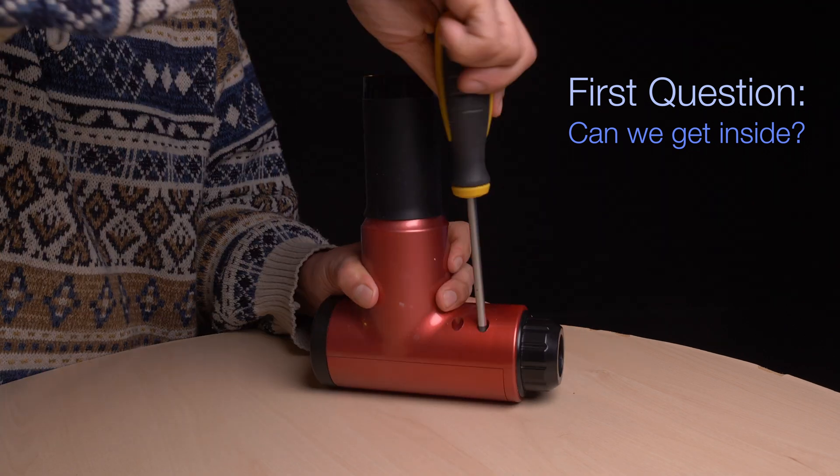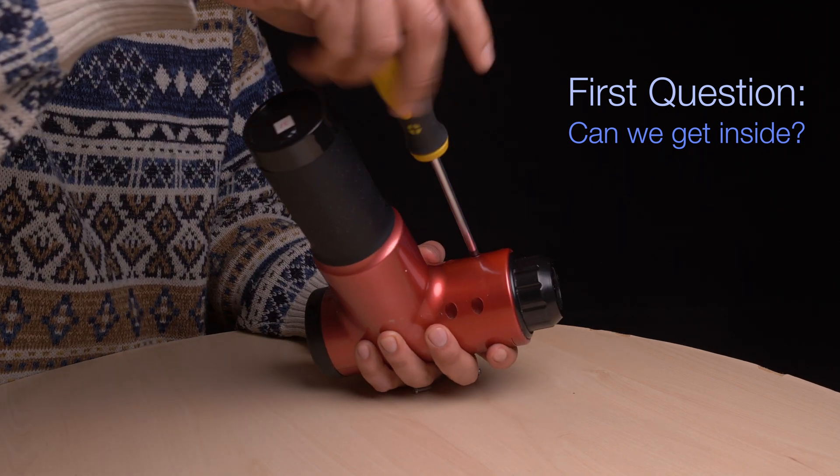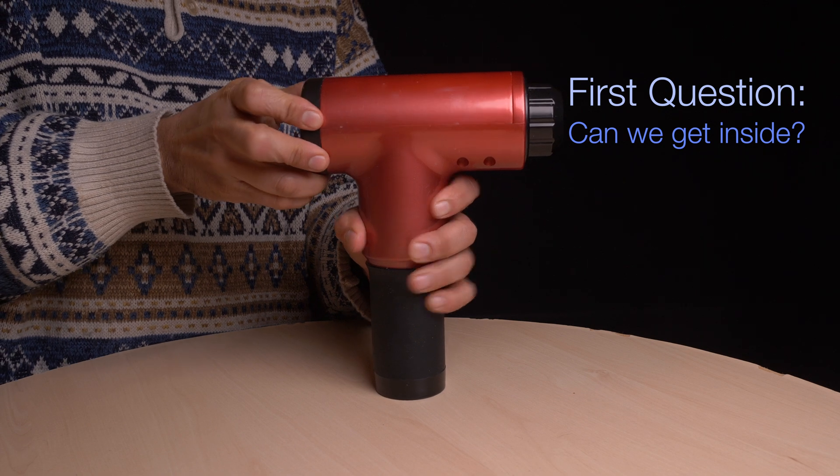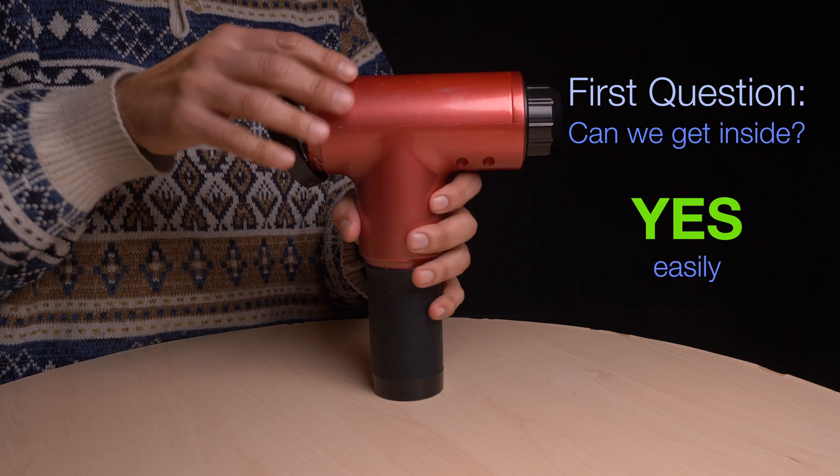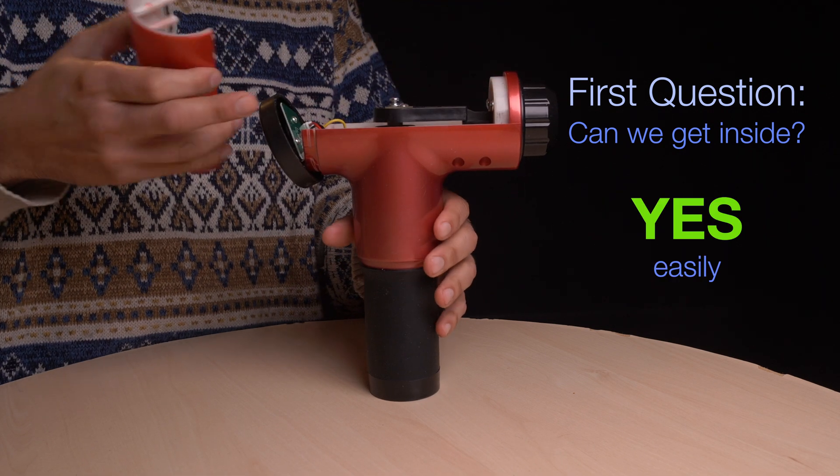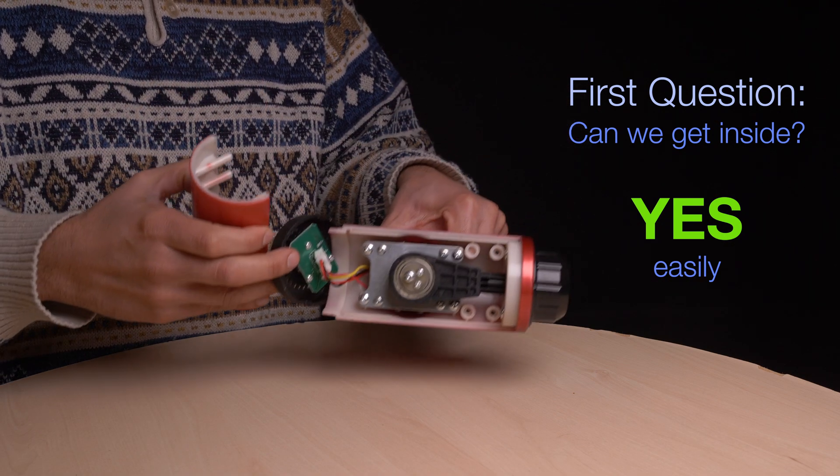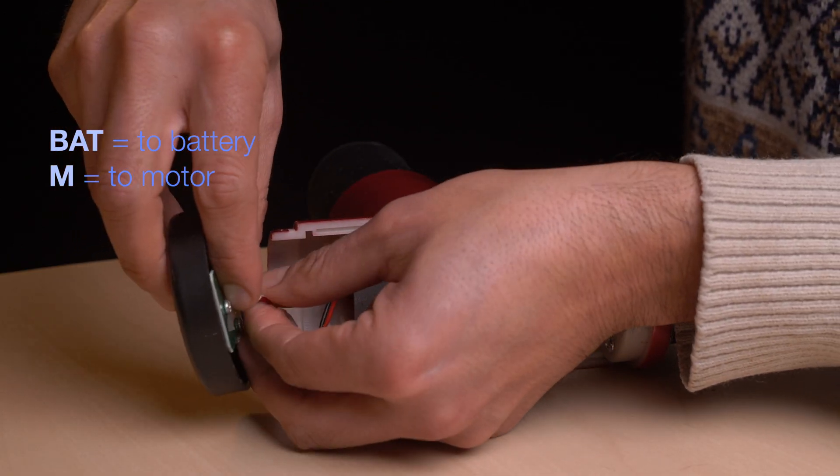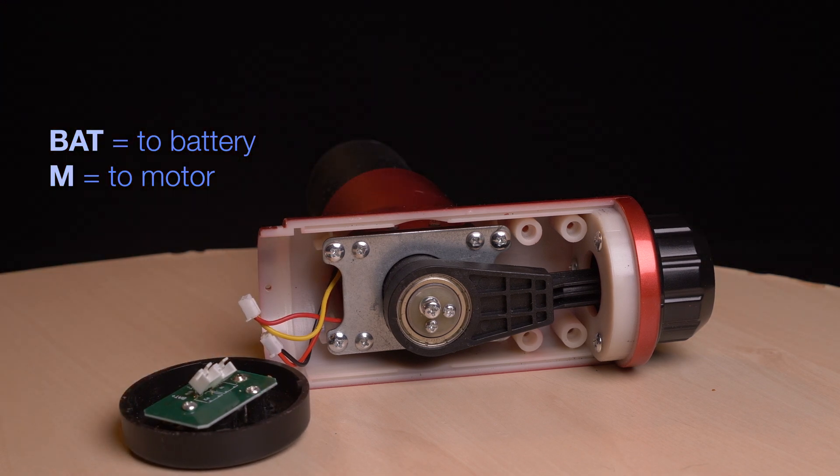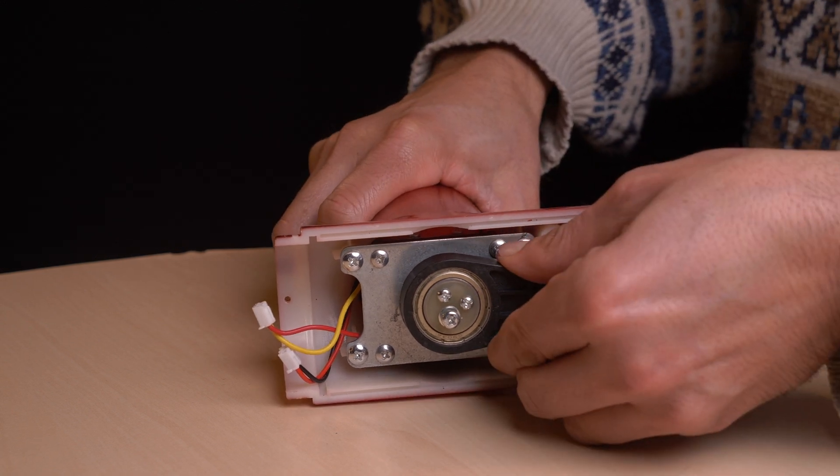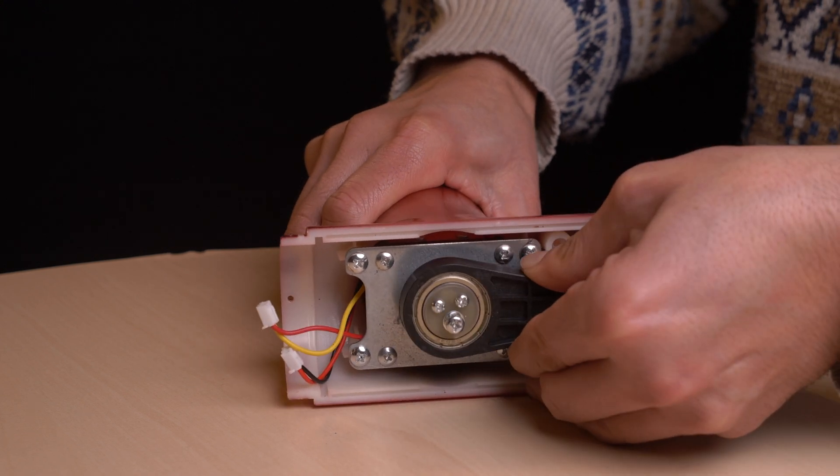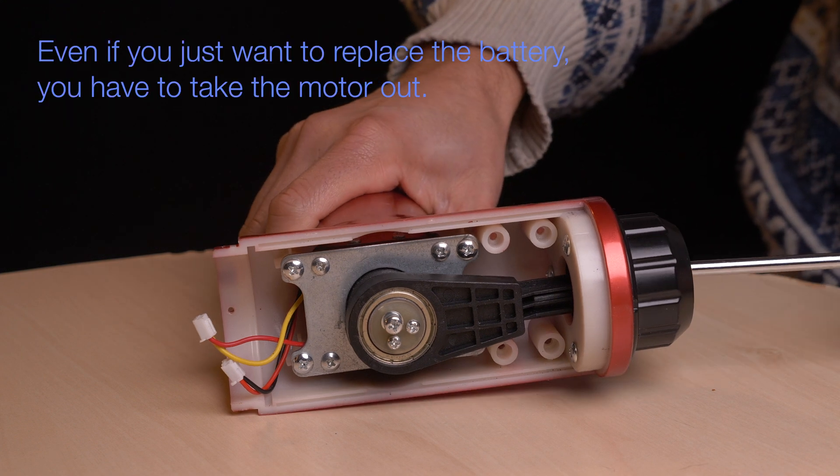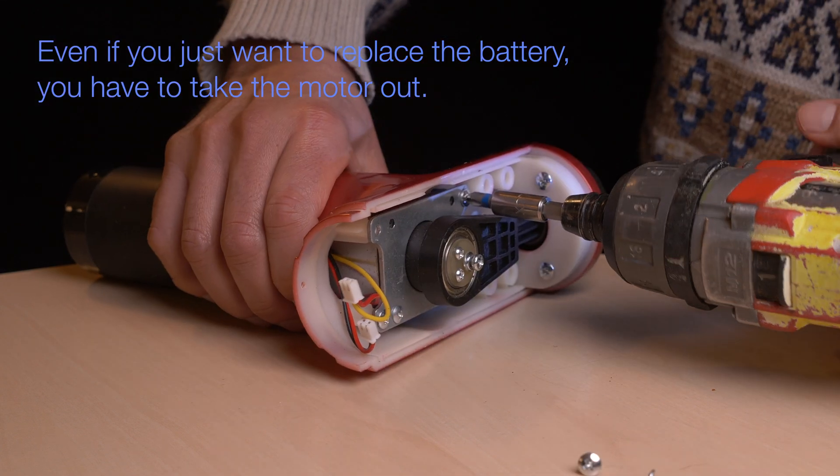Don't we all complain about how stuff nowadays is glued shut? Well, so question 1, can we get into it? And the answer is yes, easily. It's just 5 screws. On the control board, there are 2 plugs connected. One goes to the battery and one goes to the motor. This is how the rotations of the motor are being transformed into vibrations. There is just not enough space to push the connector down, the connector from the wire to the battery.